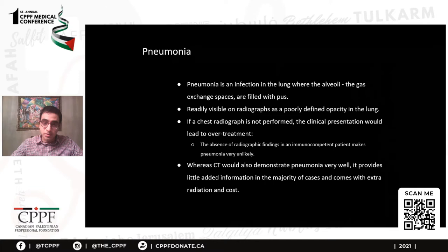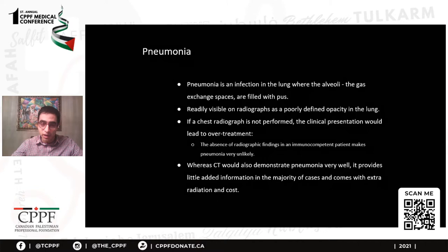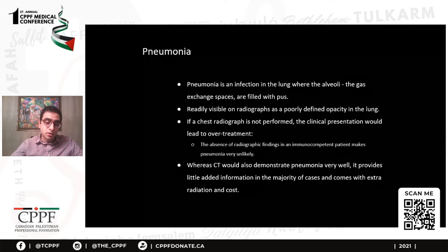And given the clinical presentation that we had, this would be consistent with pneumonia. So far, straightforward. It's an infection of the lung. It's readily visible on the radiographs. It's important to do a chest radiograph for pneumonia and not only treat clinically, because eliminating the chest radiograph will lead to overtreatment. There will be a number of patients who present with fever and shortness of breath who might not have pneumonia on radiograph. These might have viral illness, and as such, antibiotic treatment would not be beneficial. So when you are suspecting a diagnosis of pneumonia, it's important to confirm this with a chest radiograph.